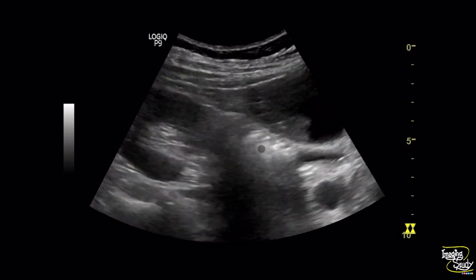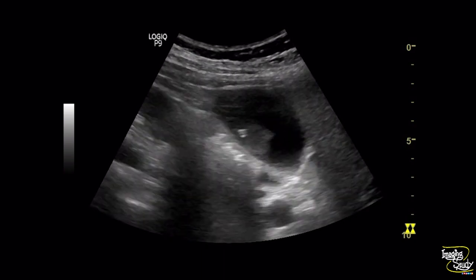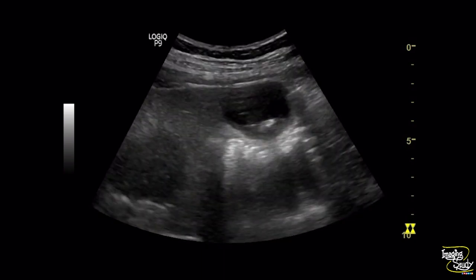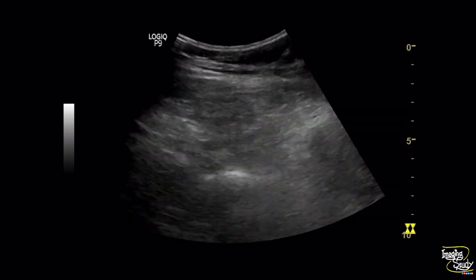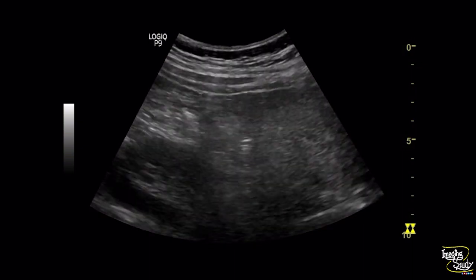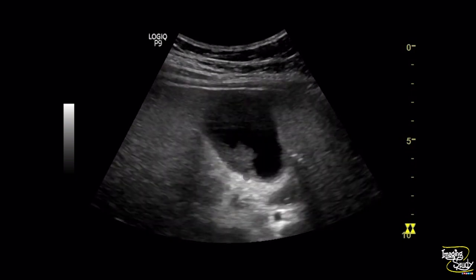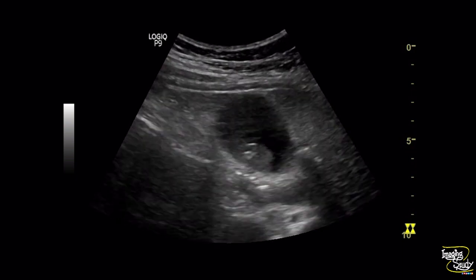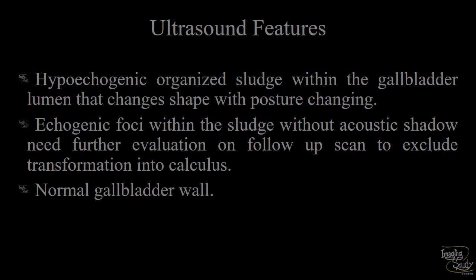This may look like a gallbladder mass on first impression, but you can see during scanning that the shape of the structure is changing. The echogenic foci within this lesion are not casting any posterior acoustic shadow. This hypoechoic area with internal echogenic foci is diagnosed as organized biliary sludge.